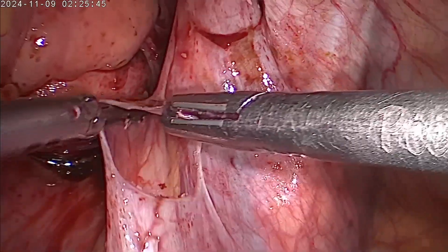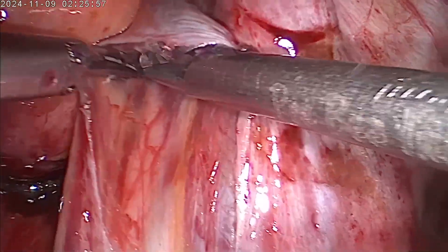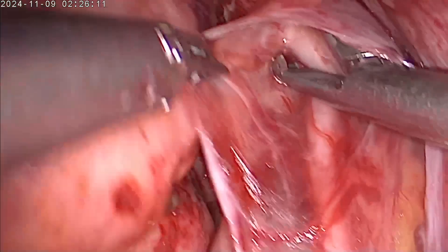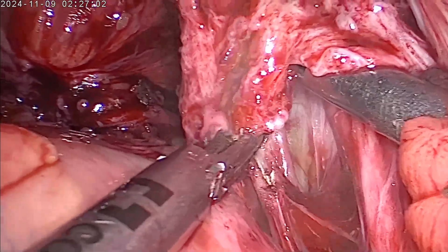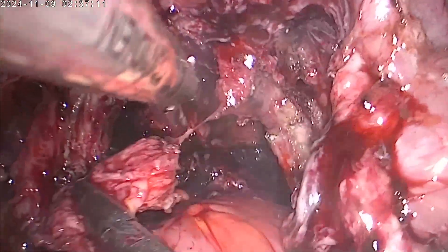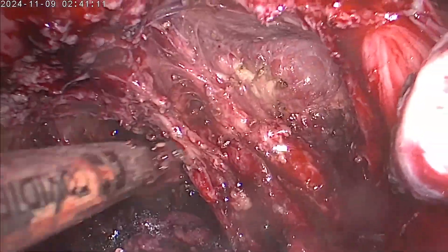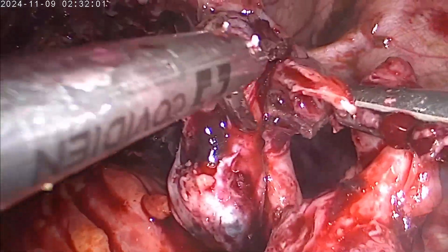Right ureter dissection is now carried out, and the nodule on the right side of the uterus is now being removed. Bilateral salpingectomy is done because in this situation, unfortunately, both the tubes appear irreversibly damaged.